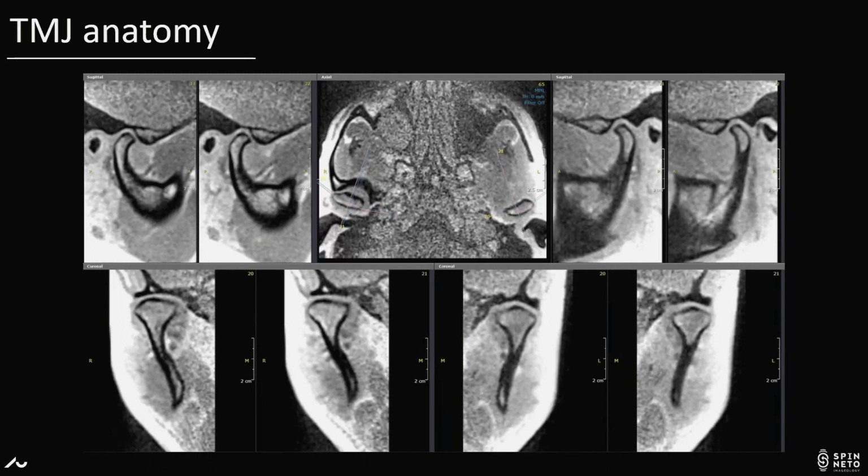So one thing that I'm challenging industry is, can we maybe move to a one modality? Is the depiction of bone good enough to determine DJD on an MRI? In the existing MRI, the answer is no, it is not. But can we tailor it so that we can get there?